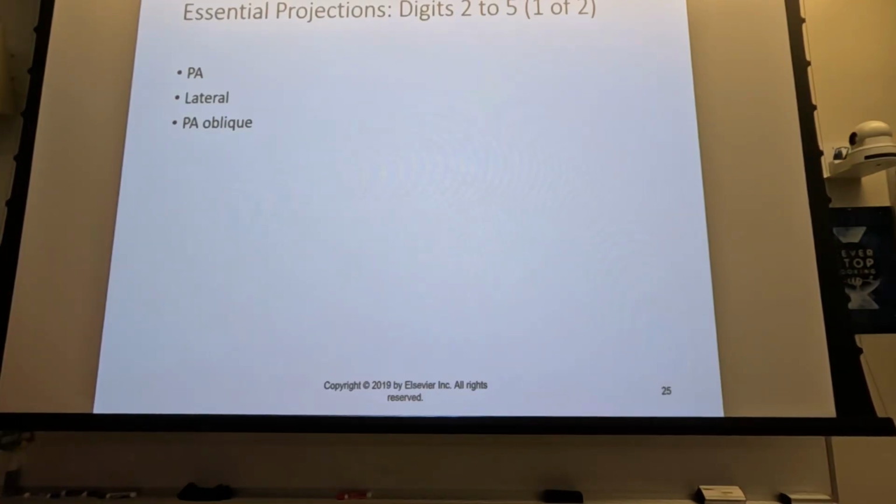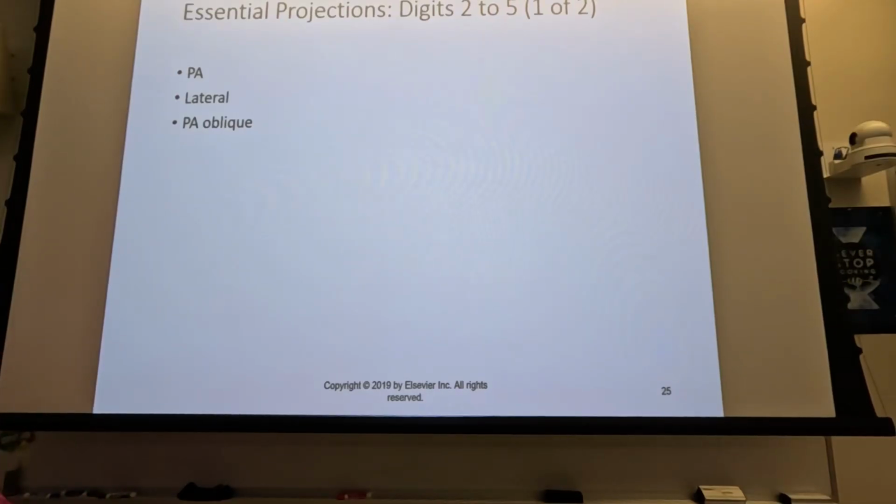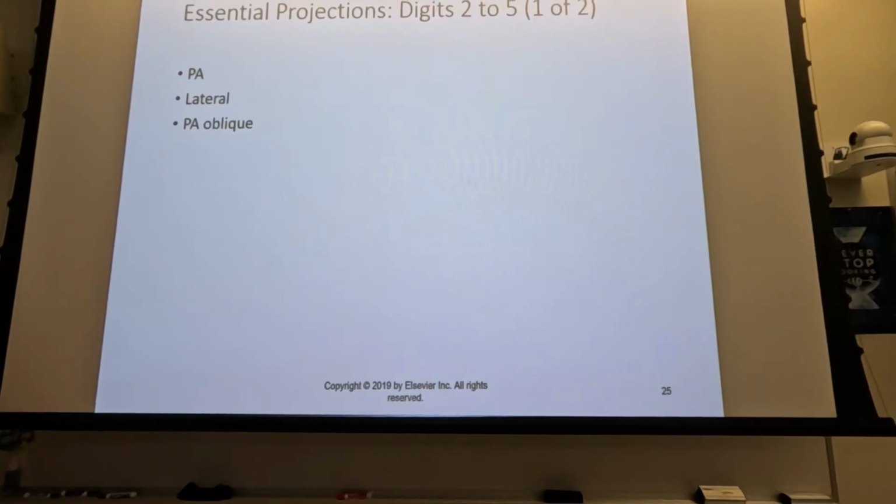is positioning of the patient. If they're not what we refer to as a walkie-talkie patient, you put them on a stool, and you roll them up to the end of the table.